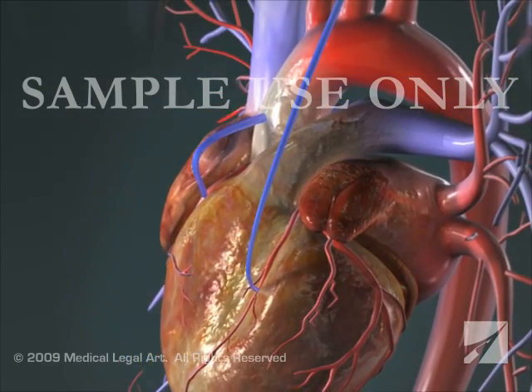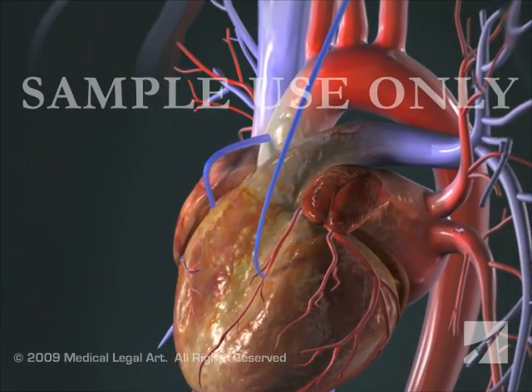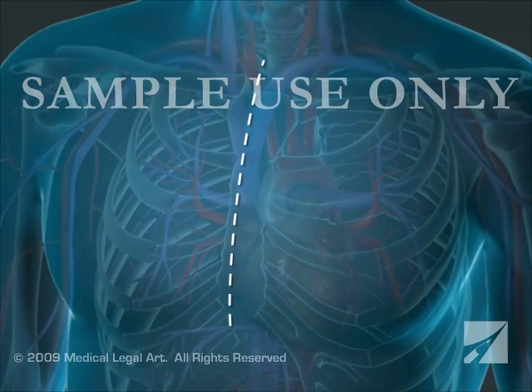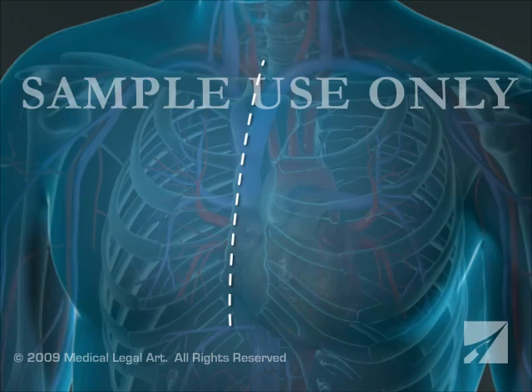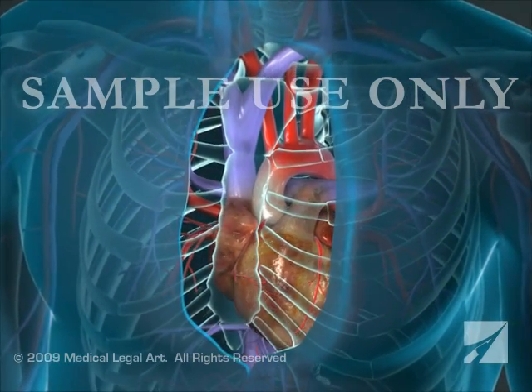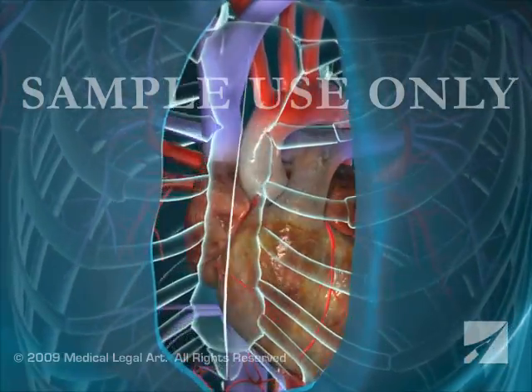One or more coronary arteries may be bypassed during a single operation. Your surgeon begins by making an incision in the skin over your breastbone or sternum, then cuts the sternum and moves your ribcage in order to get to your heart.